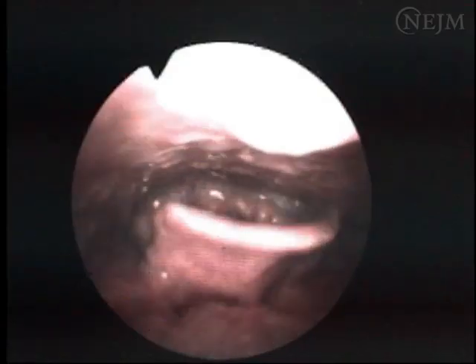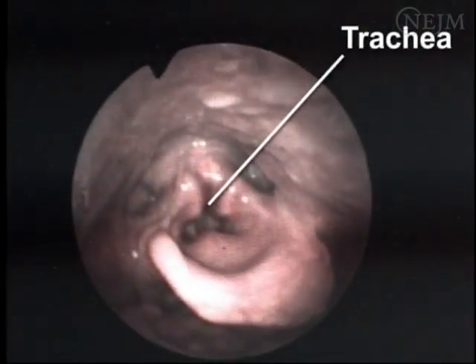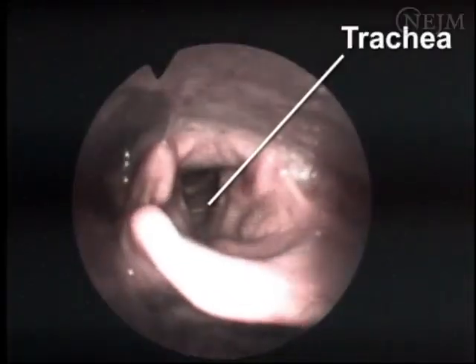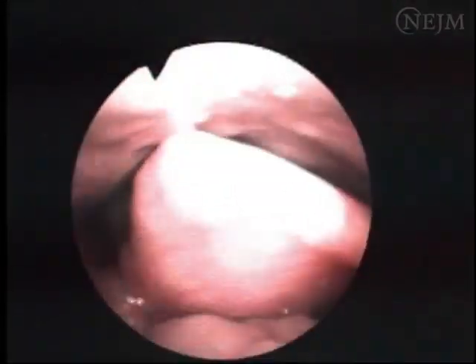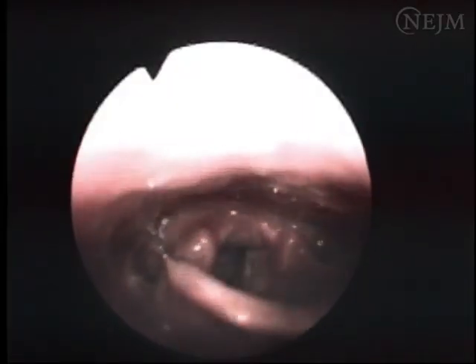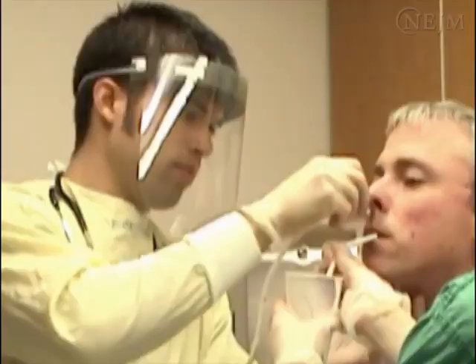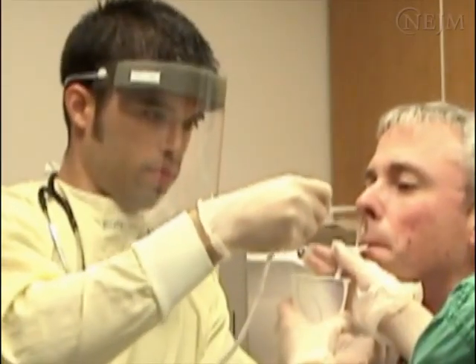As the tube reaches the level of the larynx, advancement is temporarily halted. The tube is then inserted as the patient swallows, and, once past the larynx, is rapidly advanced. Note that in this endoscopic view of the larynx, the trachea is frequently open and may be accidentally intubated with an NG tube. Note also that as the patient swallows, the laryngeal apparatus rises and the epiglottis covers the glottis, preventing tracheal entry. Once past the larynx, the tube may be inserted rapidly to the predetermined depth.